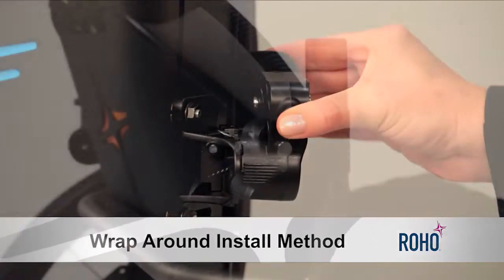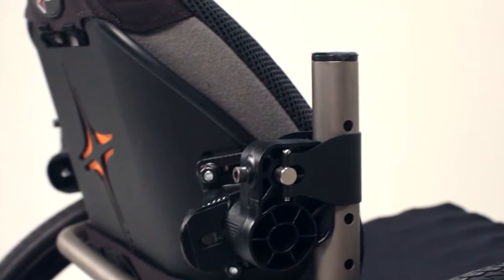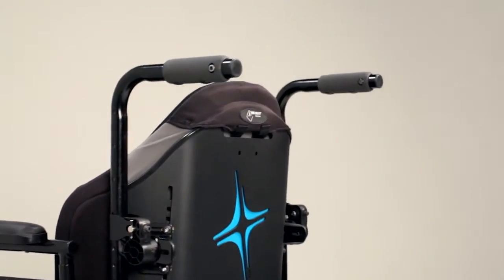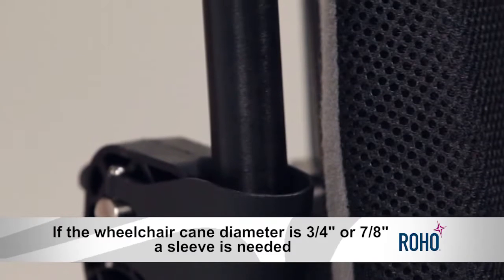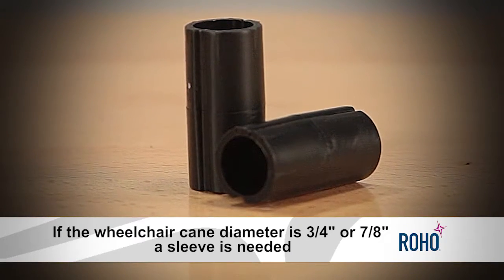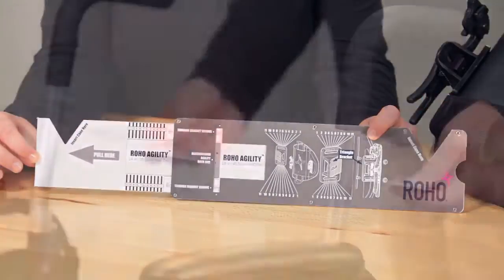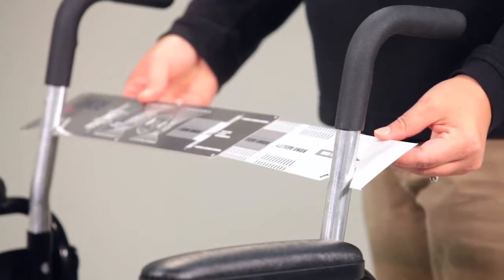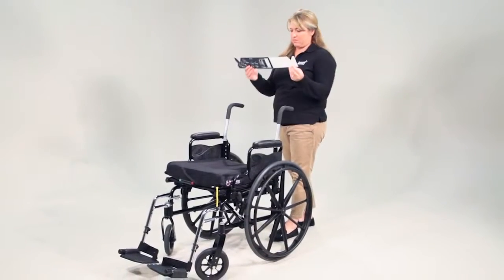or the wraparound install. The quick install is perfect for wheelchair canes without push handles, as shown here. For wheelchair canes with push handles, like this one, you will use the wraparound installation method. If the wheelchair cane diameter is 3/4 inches or 7/8 inches, a sleeve is needed. As with any of our Agility backs, use the Agility Slide Rule to measure and adjust the width with the triangle bracket for the best fit. Once your triangle bracket is adjusted properly, begin installation.